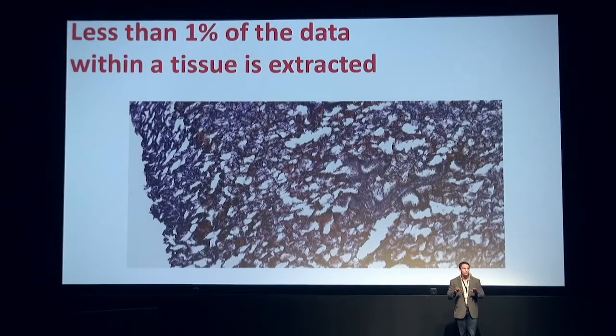Now, what I'm going to talk about are the two major limitations with this approach and what our company is actually focused on addressing. So the first of which is that less than 1% of the data from a tissue is actually used today. So we take out a biopsy from a patient, which is part of a tumor. We're only taking a few ultra-thin two-dimensional slices from that tissue. Now, this is very problematic because if I have a biopsy, which is really complex, it's really heterogeneous tissue, I could have a biomarker here, another one here that's very important, and if I take a two-dimensional slice over here, I'm missing that information.